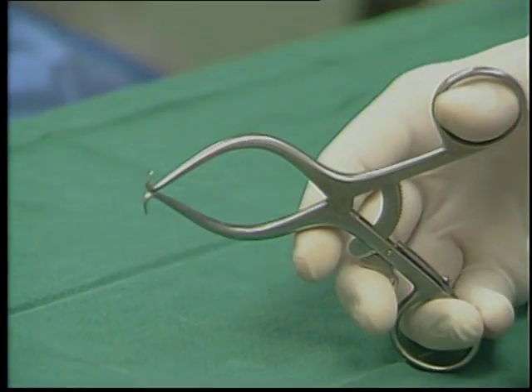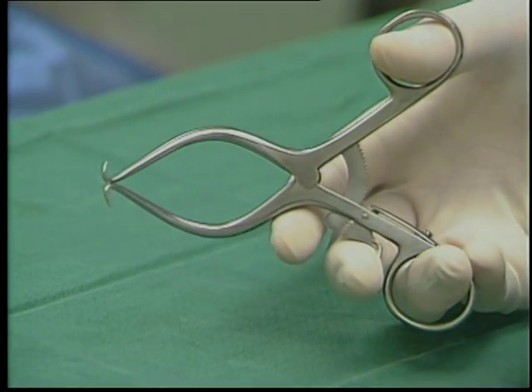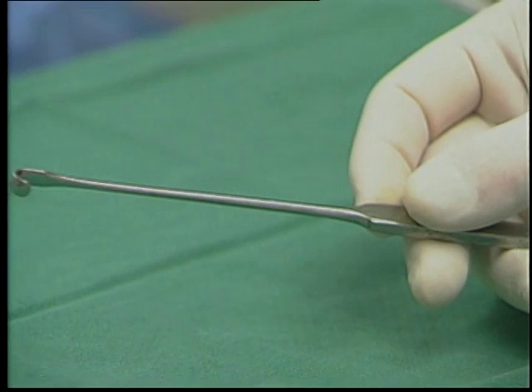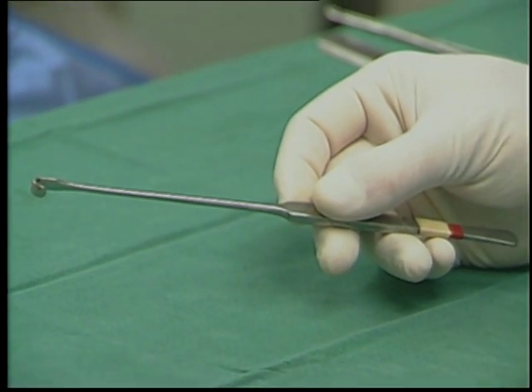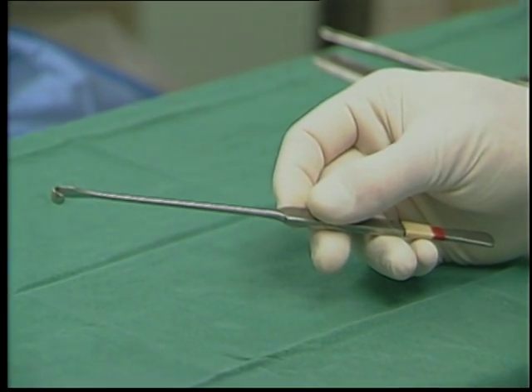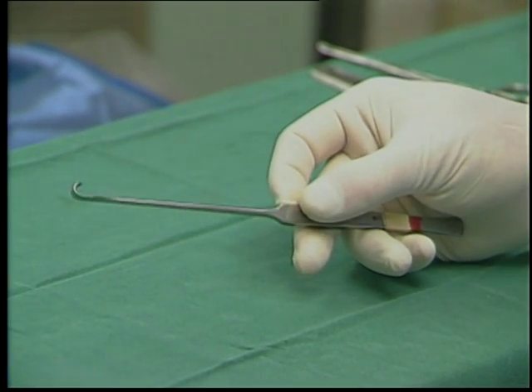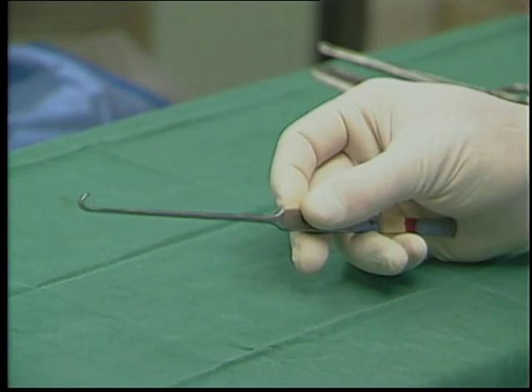Retractors are instruments designed to hold back tissues. The retractor properly used allows the surgeon to visualize more readily the tissues they are attempting to work with. A common variation of the retractor is the Snook ovariohysterectomy hook. This instrument helps the veterinarian gain control of the uterus when performing an ovariohysterectomy or spay.